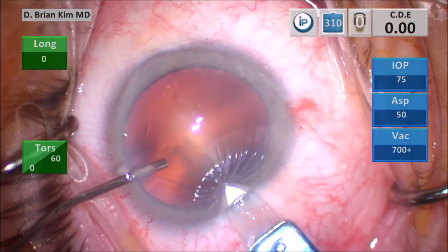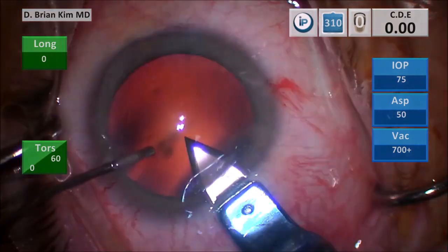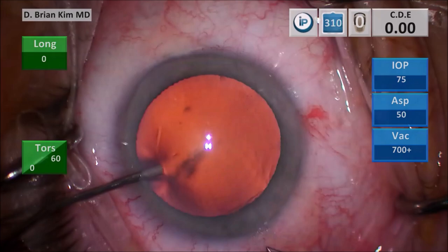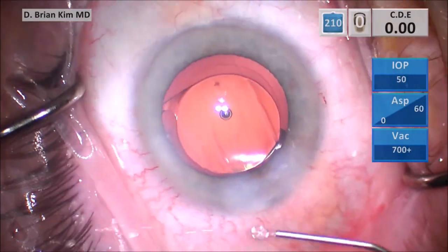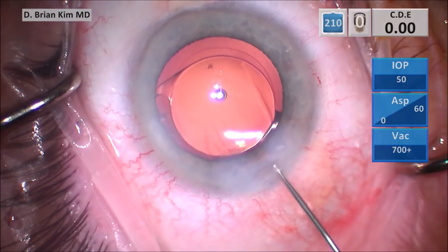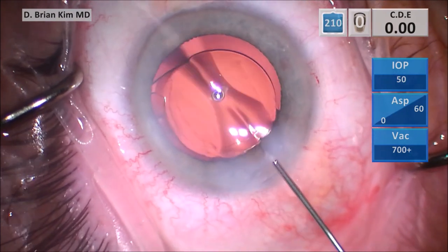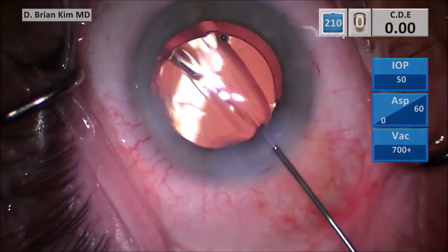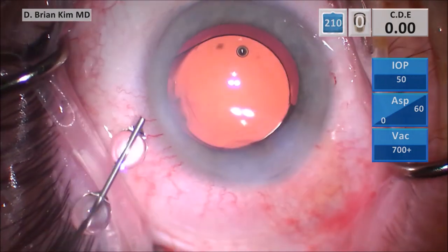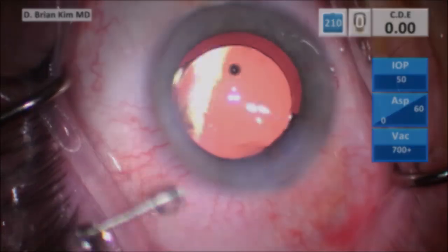You want to hydrate the incisions — hydrating to the left and then to the right. Then tilt the cannula up a little bit, make sure you get into the stroma, and sweep into the roof of the main incision. You'll see the hydration of the cornea there. Then perform hydration of the side and then hydration of the roof of the paracentesis.